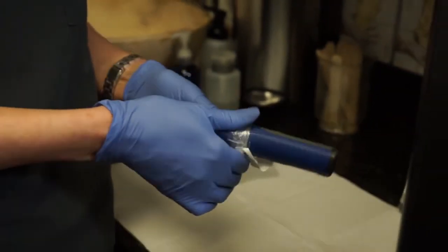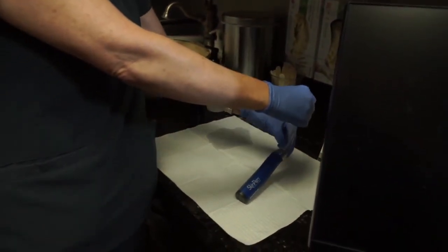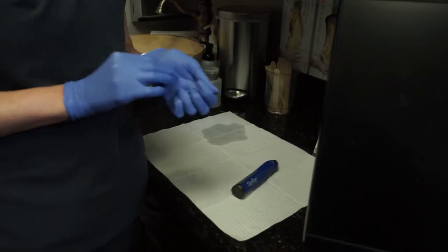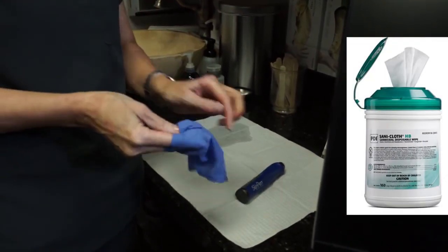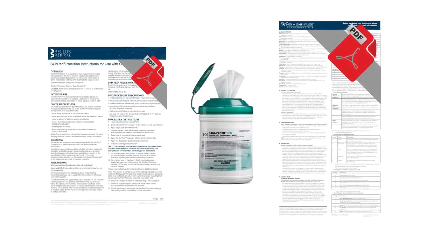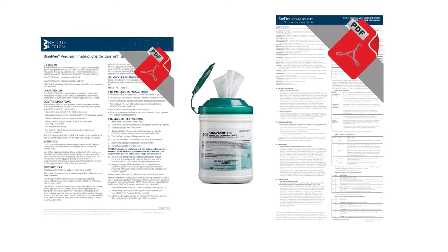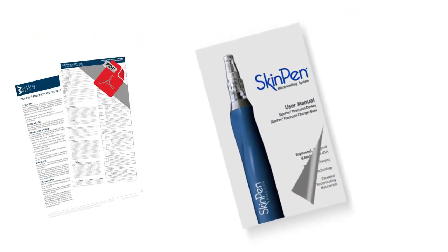Remove the biosheath by carefully rolling it down the SkinPen to prevent soiling the handpiece, and dispose of the single-use sheath in a biohazard container. Disinfection of the SkinPen Precision should be completed with the use of SaniCloth HB wipes. For additional details on how to clean your SkinPen, see Section 9 of the IFU Cleaning of SkinPen Precision and Charger Base, or review the SkinPen User Manual.